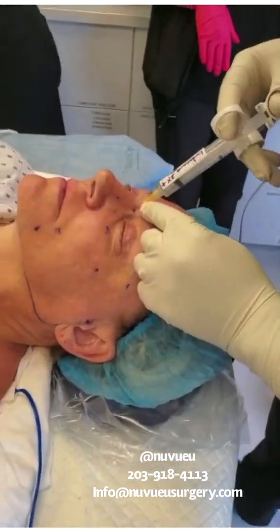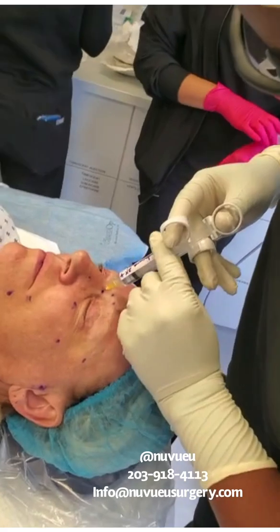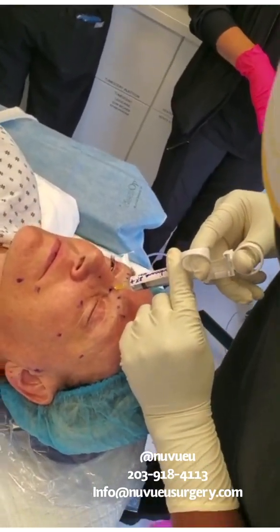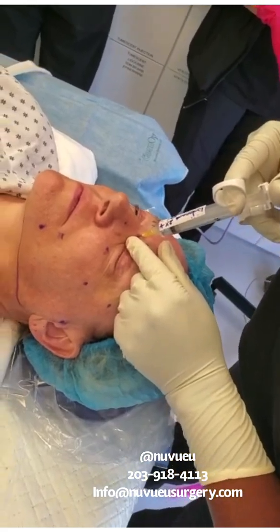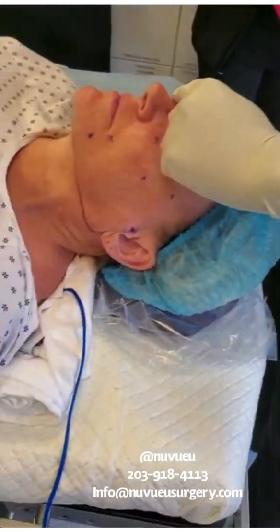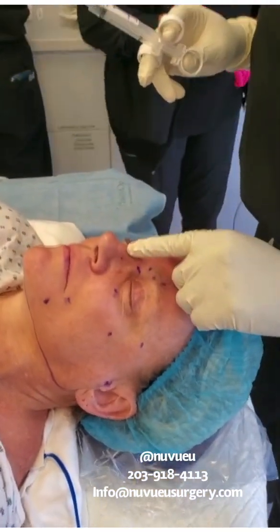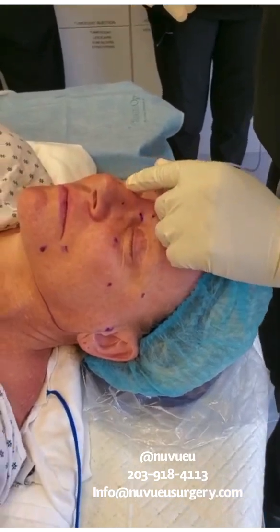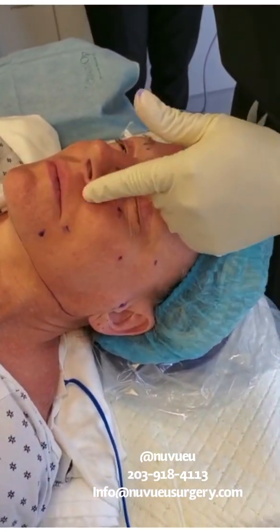I'm going to do the same thing here — go all the way down, aspirate. And now for the external nasal, which supplies the nose. This nerve supplies the bridge of the nose, while the external nasal supplies the tip of the nose and all of this area.